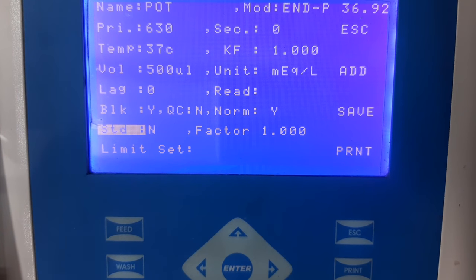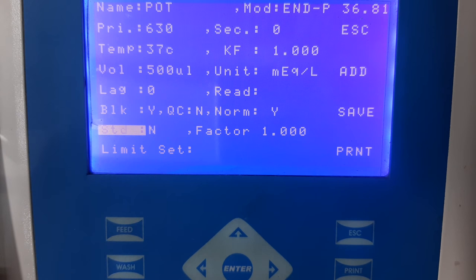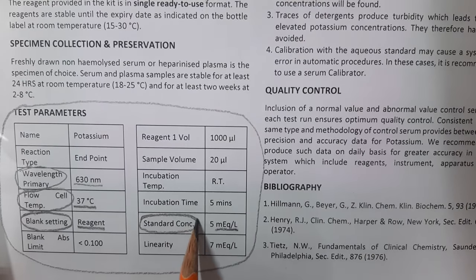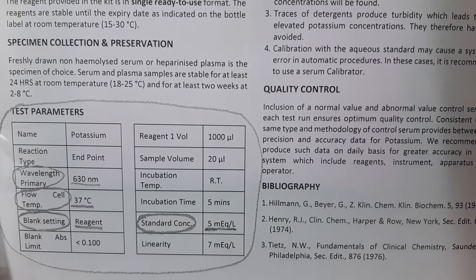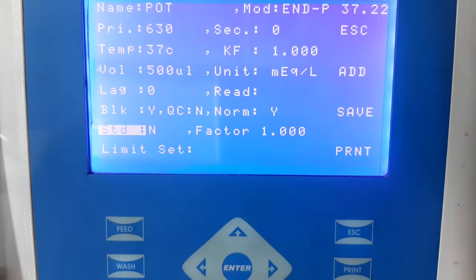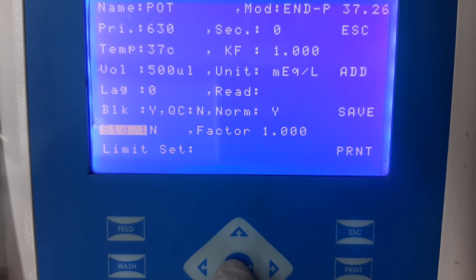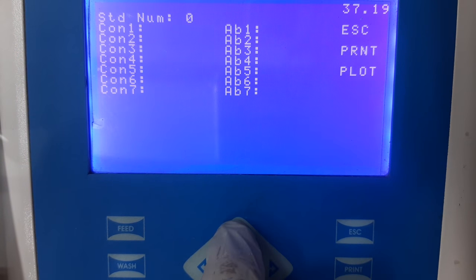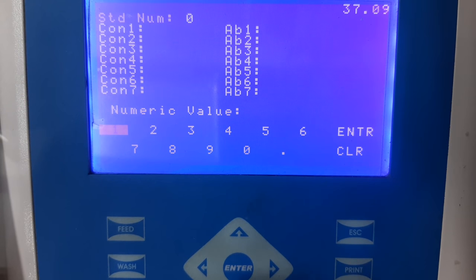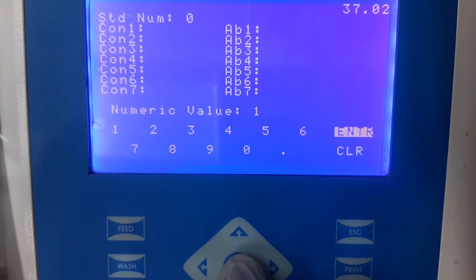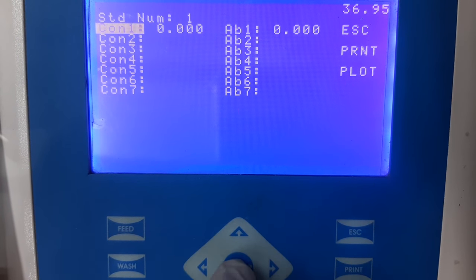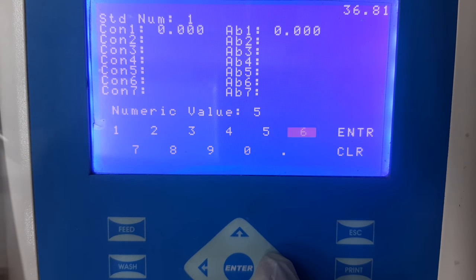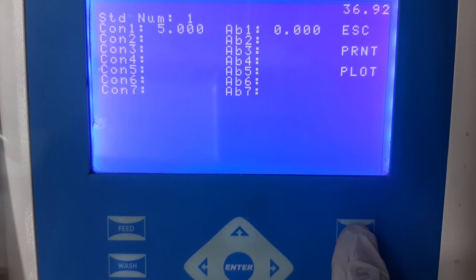The next information is standard — whether the standard is available in the kit and if so, what is its concentration. This information can be seen in the instructions for use, where the manufacturer clearly mentions if the standard is available and its concentration. Select the option of standard and then select yes. Next, enter the concentration of standard. Select standard number and then select option one, because only one standard is available in the kit. Enter the numerical value of the standard concentration mentioned in the instructions for use, press enter, and escape to come back to the home screen.